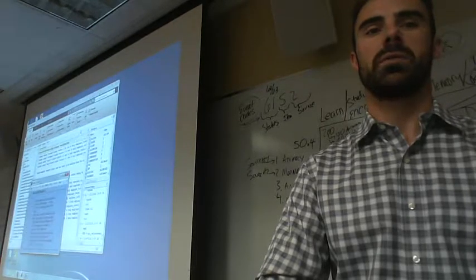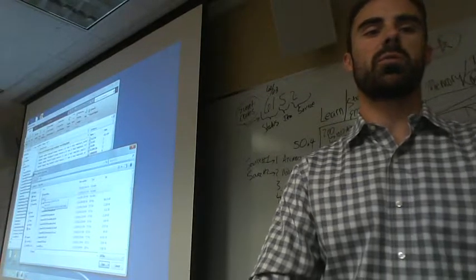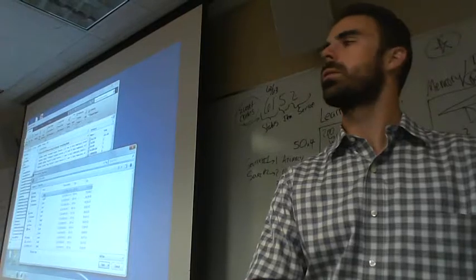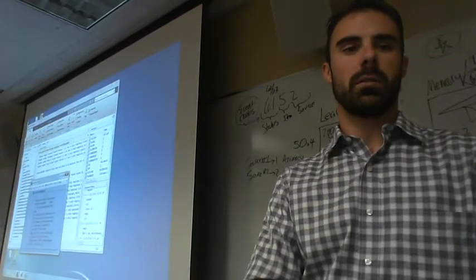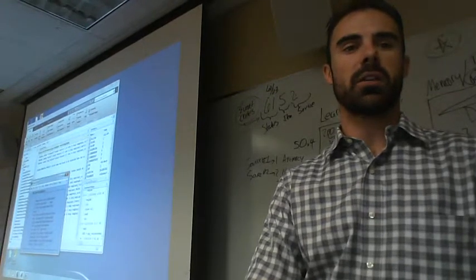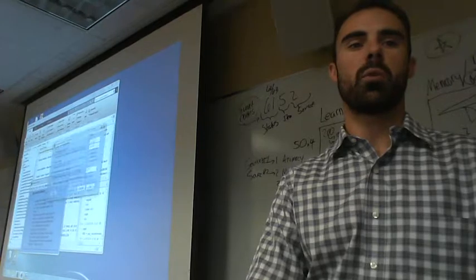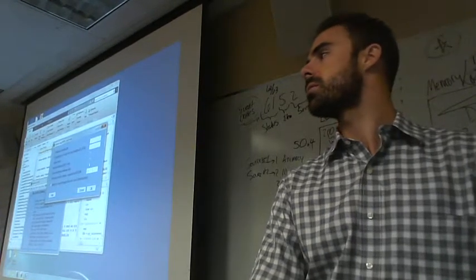Okay, we snag that. And it's going to ask us, so let's take one of our BDF files here. Let's start with 4. So everybody should have 4. Okay, and then we select that, and it starts to think. It's going to ask us a question as it starts to import it about our reference channels. What's a reference?